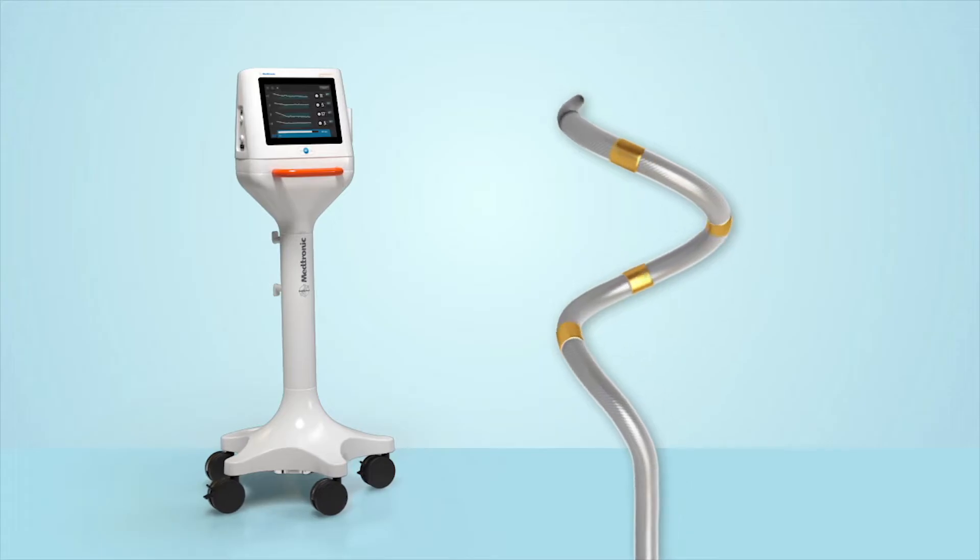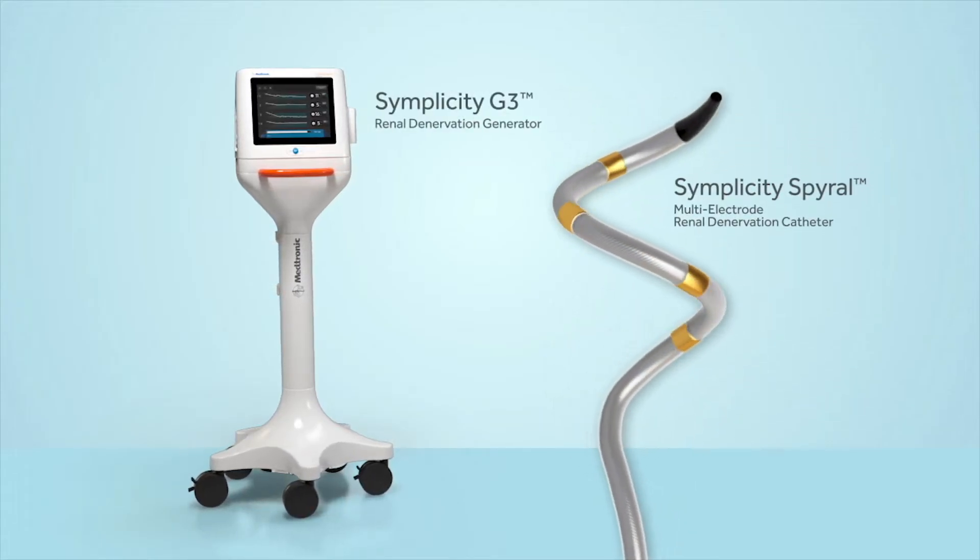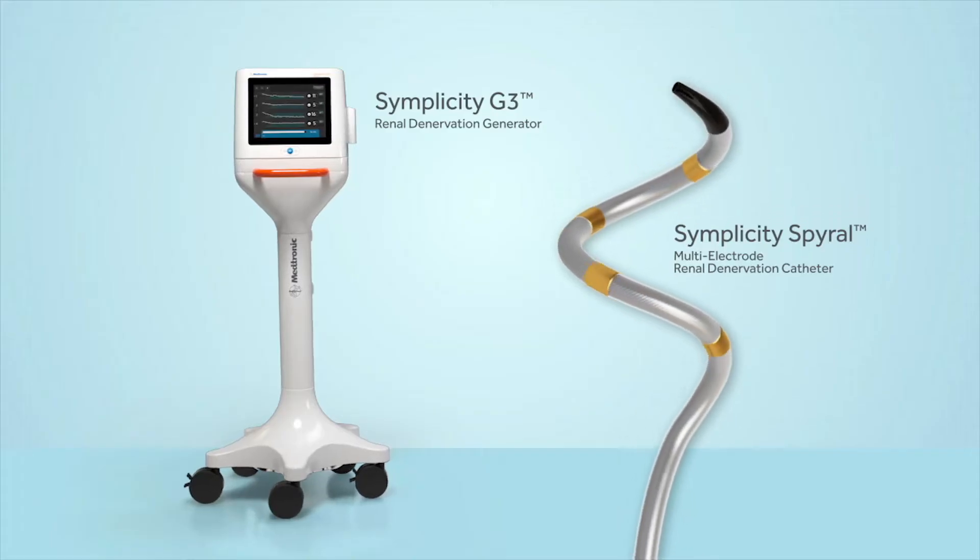Introducing the Simplicity Spiral catheter and Simplicity G3 generator from Medtronic, the pioneer of renal denervation.